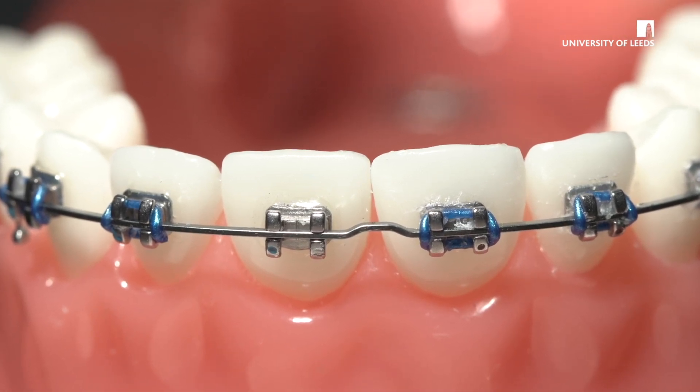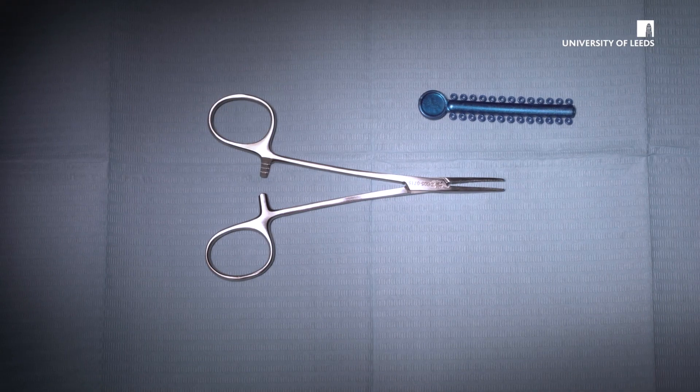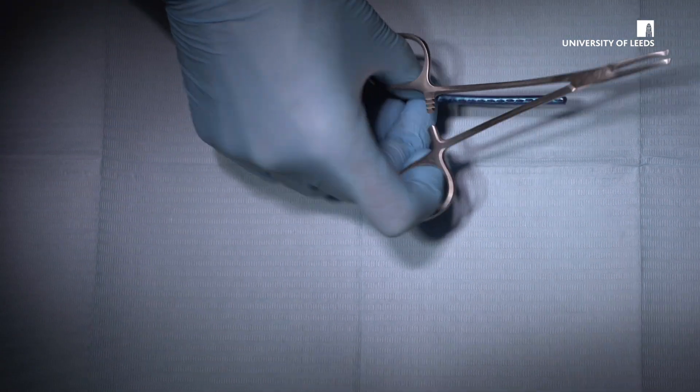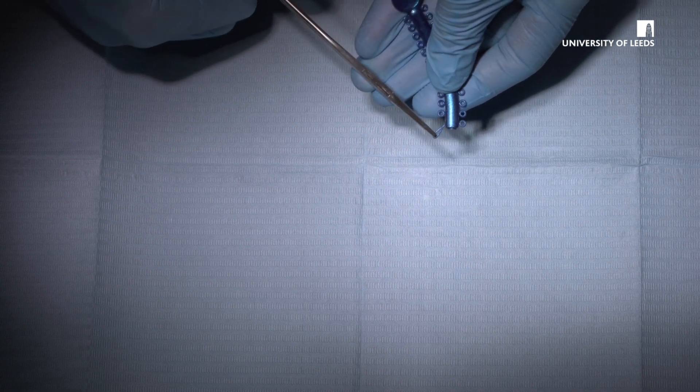If possible, try and discuss the situation with the orthodontic provider to gain advice. To replace the module, you will need a pair of mosquito forceps and some elastomeric modules. You could ask the practice principal if you can order some mosquito forceps and modules if the practice does not already have these in stock.